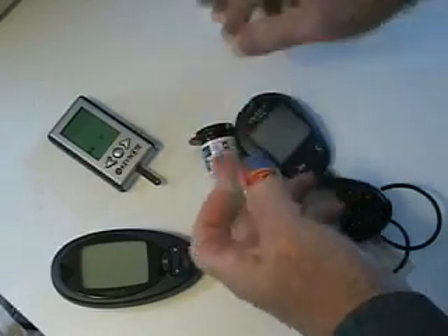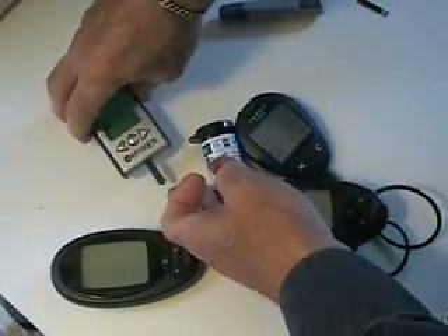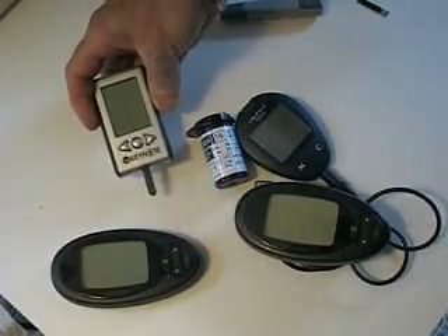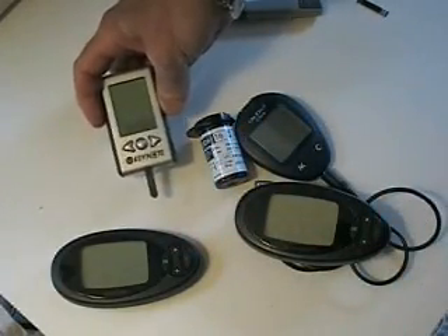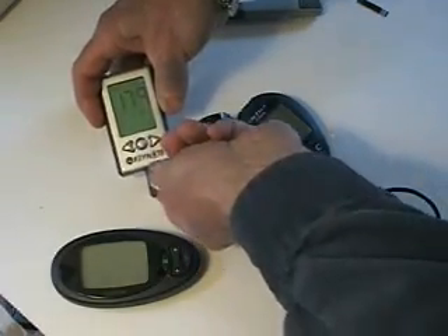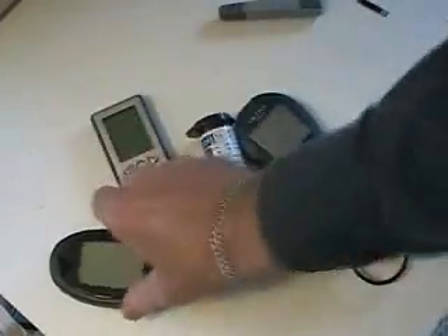That's 40 cents a strip, and it's a lot less than you pay for strips for many of the other manufacturers. It also takes a really small sample of blood. So here's the result — 179 — and here's how I calibrate it.